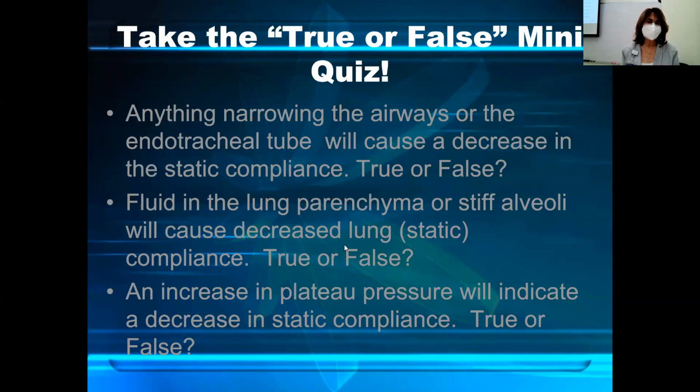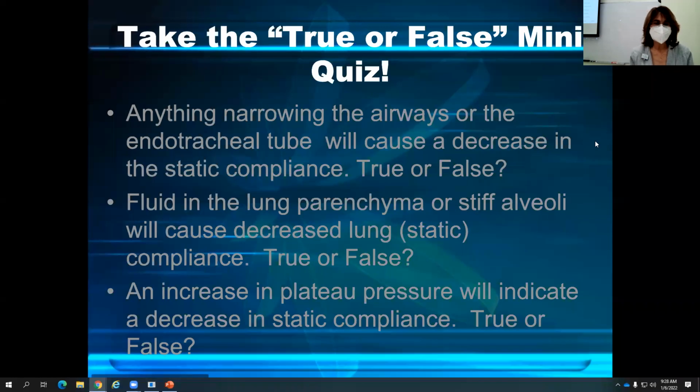Okay, so if you see lung compliance, I'm going to write that in the chat. Lung compliance and static compliance get used interchangeably. So we've introduced some terms here.